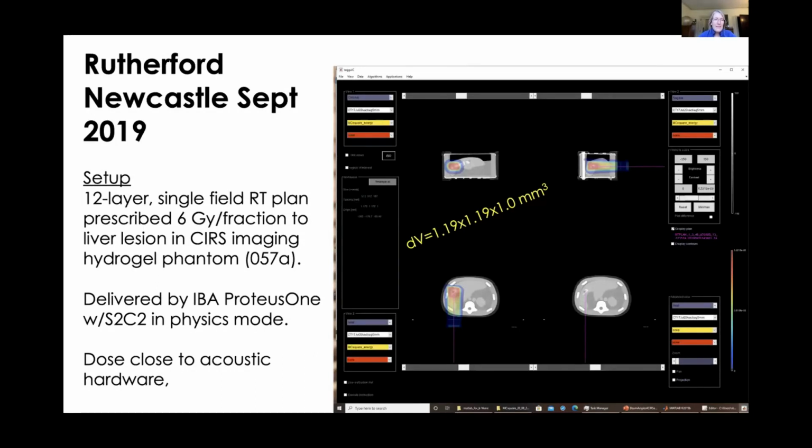And to be candid, they've had not quite as much business as they thought, so they were able to give me beam time, which was great. So I gratefully took advantage and flew over there before the pandemic, and we collected this data. I chose a multimodality imaging phantom that's mostly made of gelatin, except for some bony inserts that represent ribs and the spine. And this phantom is designed for CT, MR, and ultrasound combined.